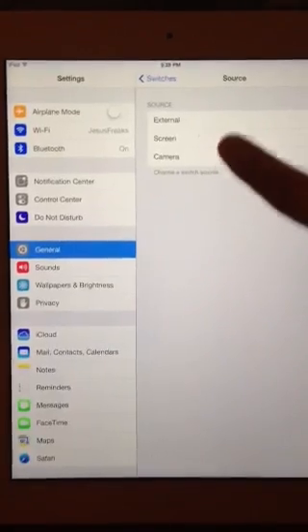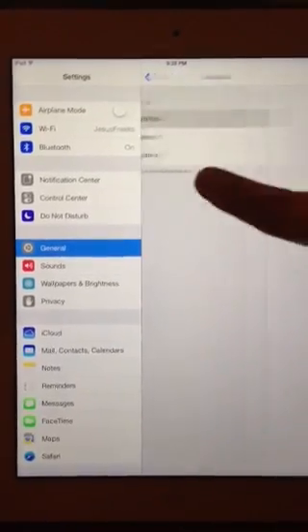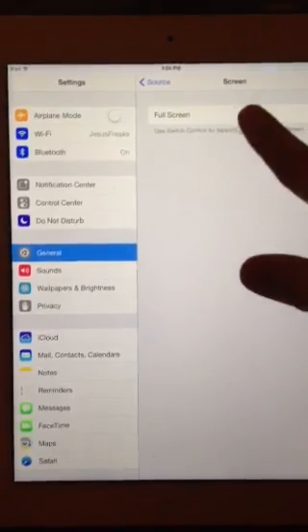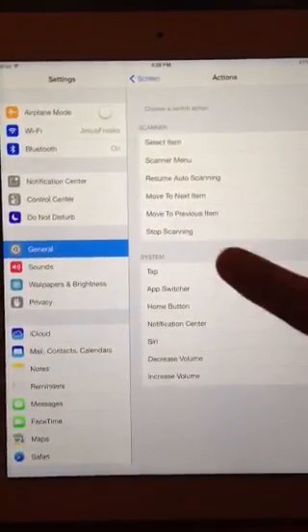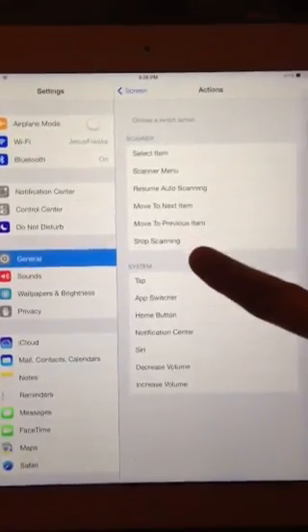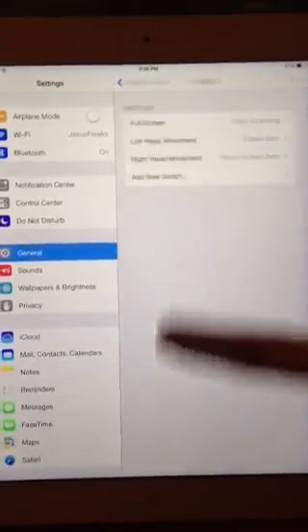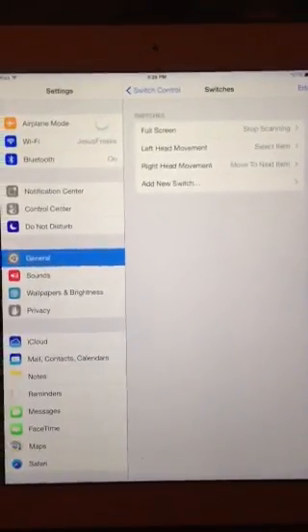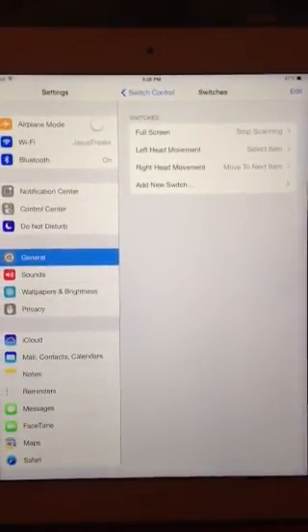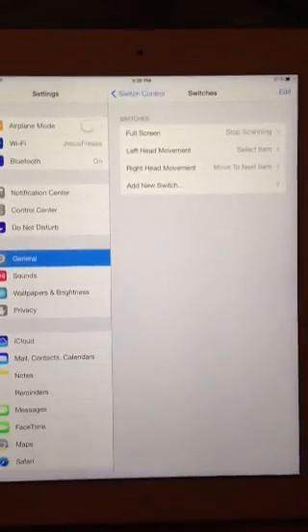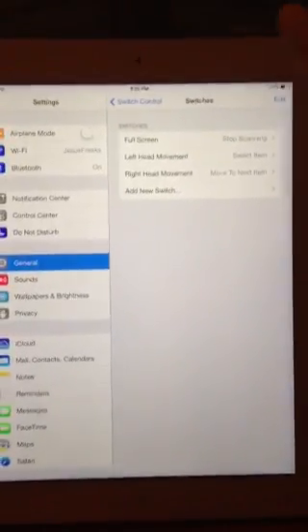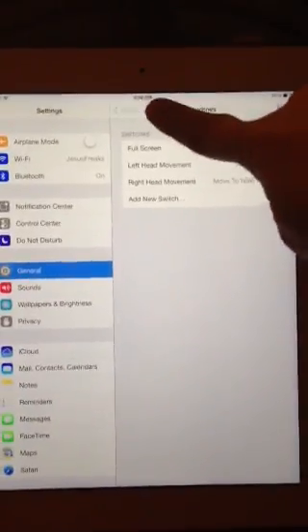I'll also add that if you do full screen — so if you touch the screen — I want it to stop scanning. So if you're helping someone and you need them to stop, you can just touch the screen and it will stop scanning without having to go in and make any other changes.